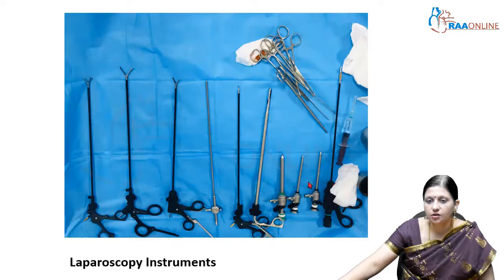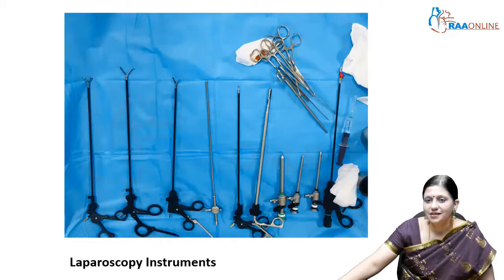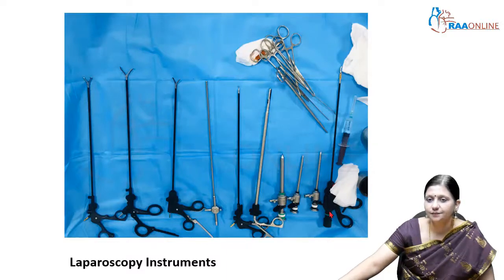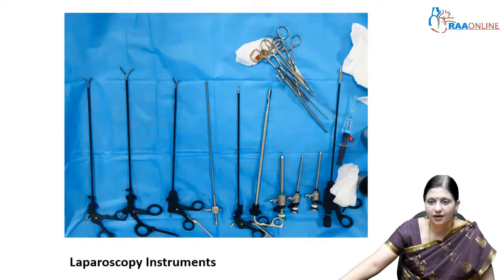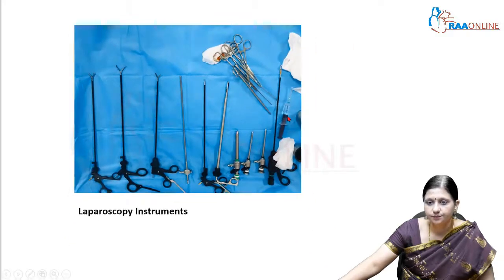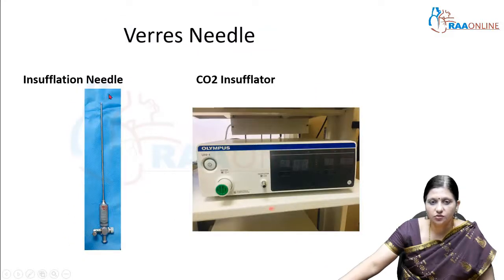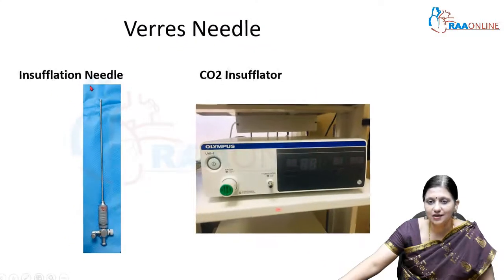These are the trocars of 10mm, 5mm, and another 5mm trocar to introduce the instruments. This is a bipolar, also called the cautery or diathermy. We also have a fluid-filled syringe to do the bubble test after the insertion of the Veress needle. So what is a Veress needle?